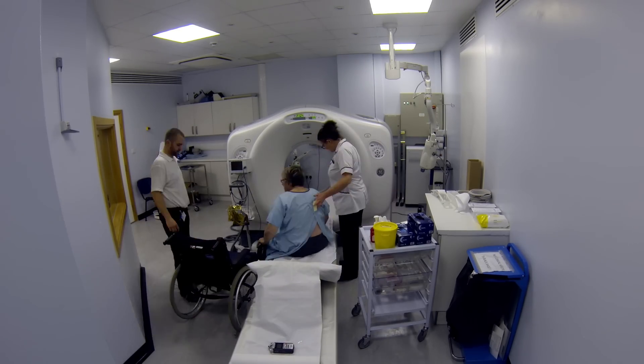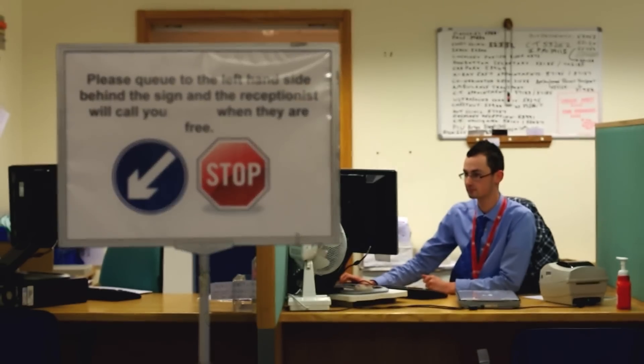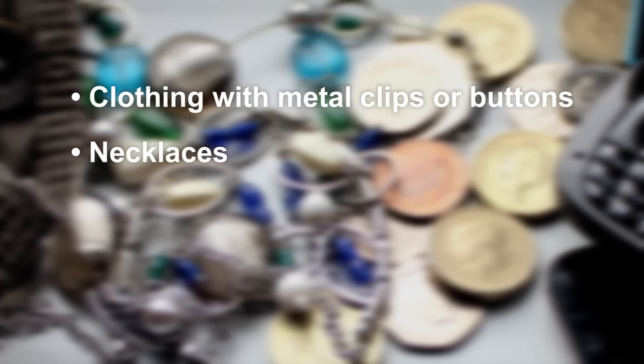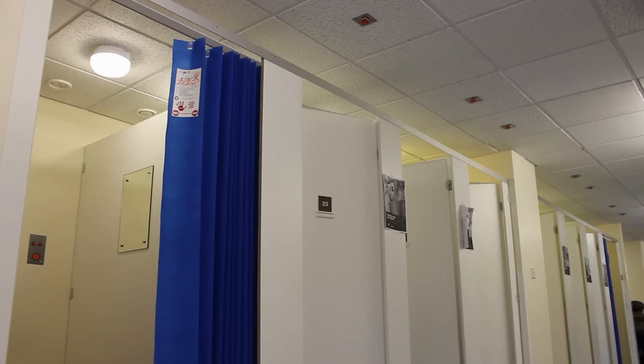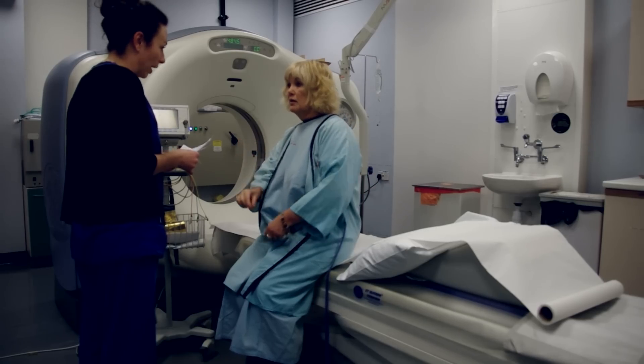Please expect to be in the department for 30 to 60 minutes. When you arrive, the receptionist will book you in. We'll need you to remove metal objects around your neck and chest, including any clothing with metal clips or buttons, necklaces, and anything in your top pockets like coins or phones. We do this because these things reduce the quality of the pictures.